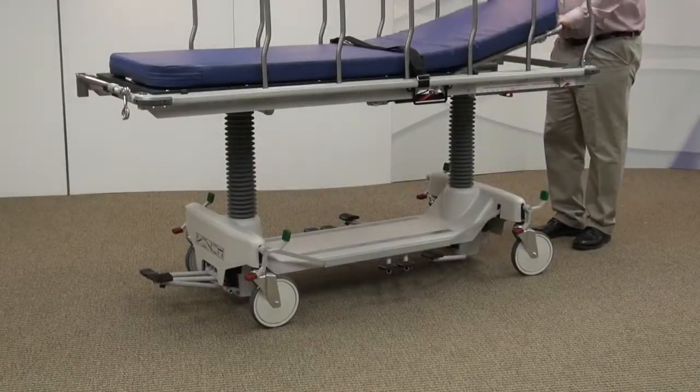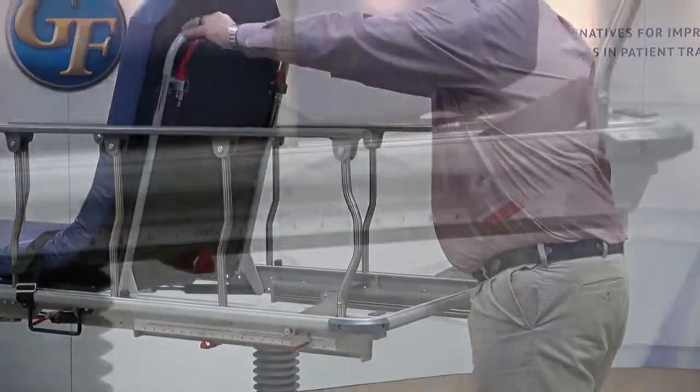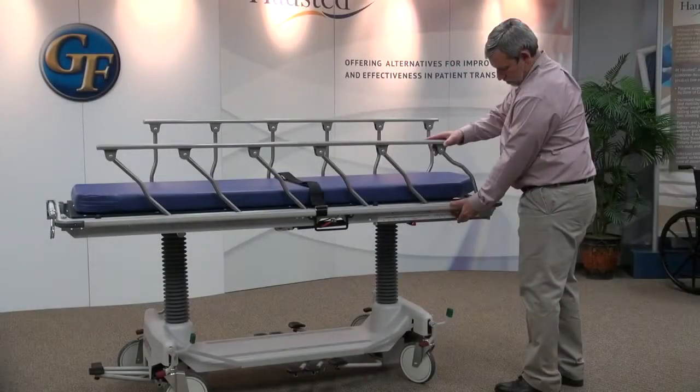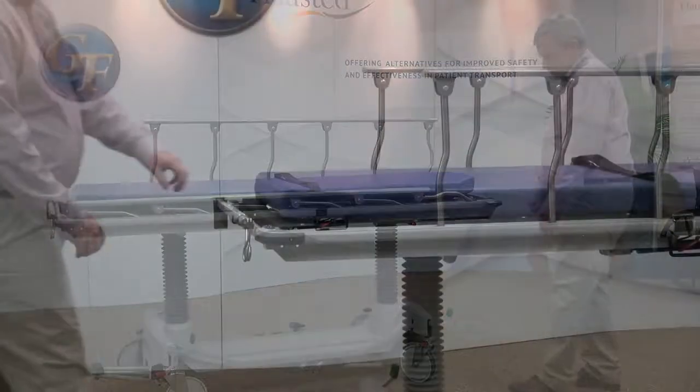The Pneumatic Assist Backrest can be adjusted from 0 to 80 degrees for patient comfort. Fold-away retractor rails have three positions: full-up for maximum patient security, mid-position for easy patient access and security, and full-lowered for patient transfer.